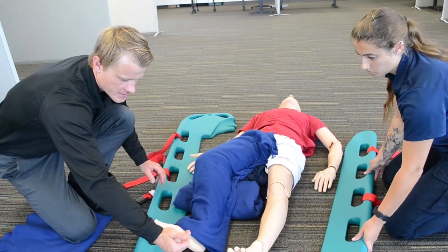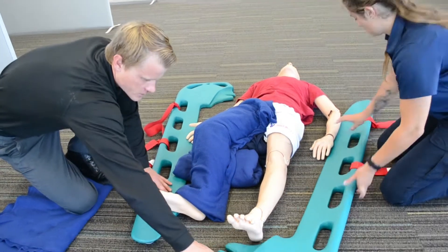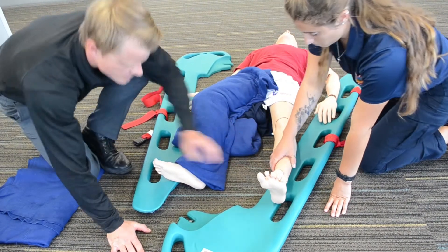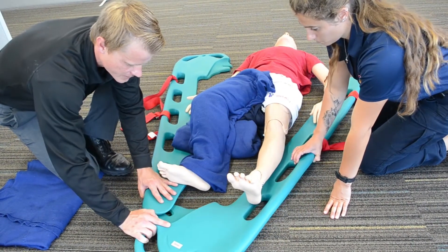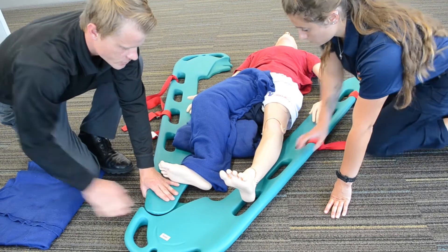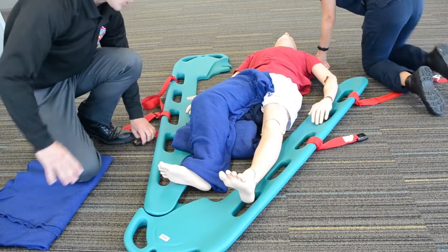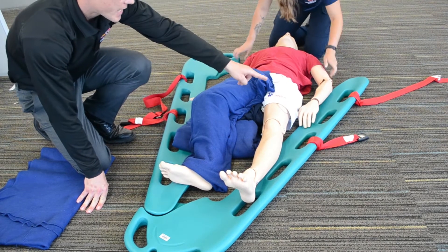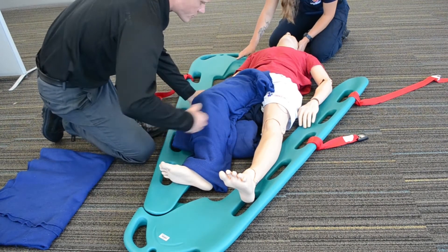When we apply the scoop stretcher, I'd like to get the feet first. So, moving the non-injured extremity to the top of the scoop stretcher, we can attach this portion of the stretcher. I'll be managing the leg while my partner manages both the head of the patient and the two halves of the scoop stretcher.